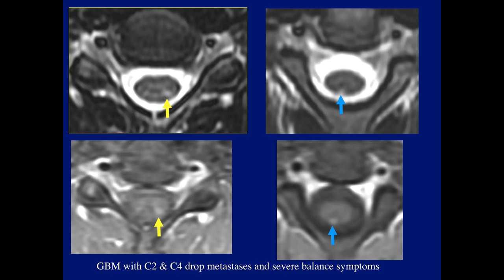Another case: a patient with GBM had C2 and C4 drop metastases and severe balance problems. There is involvement of the central gray but also involvement of either the fasciculus gracilis or cuneatus, explaining why the patient had severe balance symptoms. By knowing which structures are there, we can demonstrate clinical acuity.